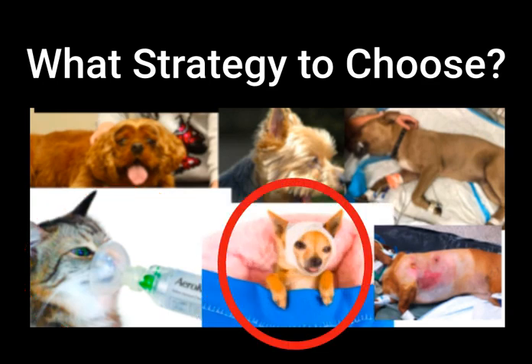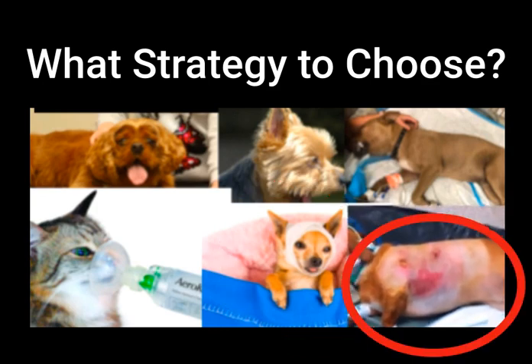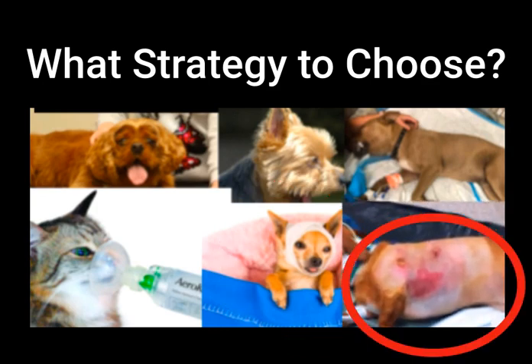Now you have a 1-year-old Chihuahua that fell out of the bed and developed traumatic brain injury. It's now not breathing well. Well, in this case, we will use the strategy of CNS disease with healthy lungs. Finally, you have a 5-year-old Dachshund whose chest was chewed on by a pit bull and now has severe pulmonary contusions. So this patient will benefit from the injury strategy.